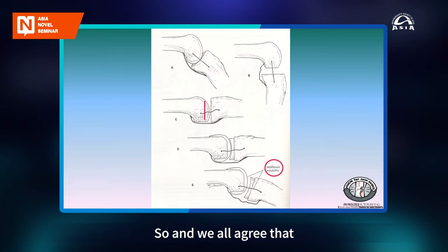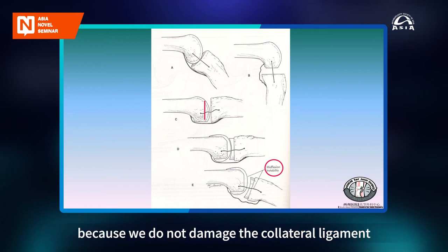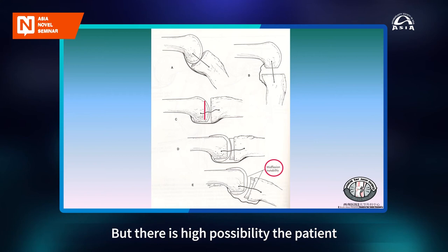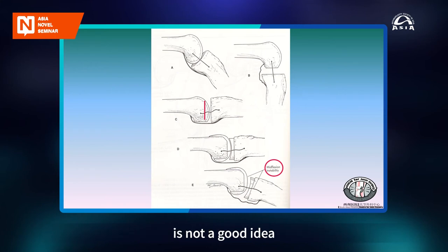And we all agree that if we correct the flexion deformity entirely by removing distal femur, we can encounter another problem, that is mid-flexion instability. If we cut too much bone, we can get a stable extension gap, and we can also get a stable flexion gap because we do not damage the collateral ligament. But there's a high possibility the patient has mid-flexion instability after surgery. So removing too much bone from the distal femur is not a good idea.